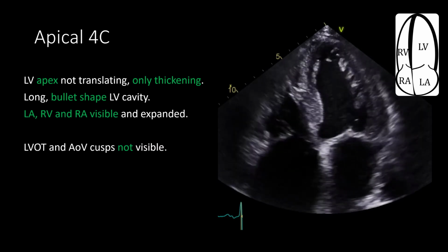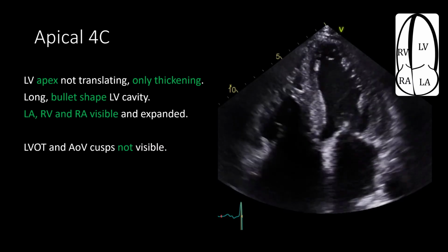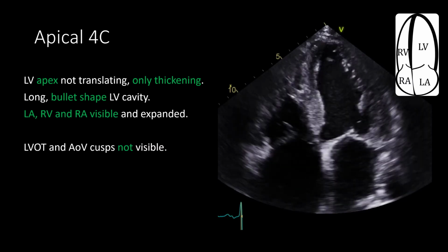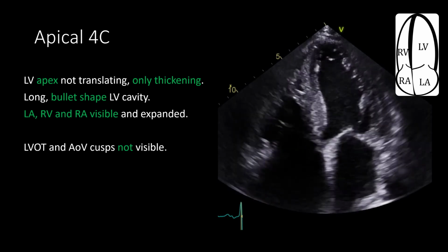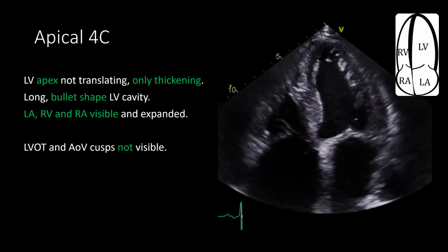The left atrium does not have to be at its longest size, as it often expands not in the same axis as the left ventricle. The right ventricle may not be entirely visible at all times, and this is commonly accepted as adequate.